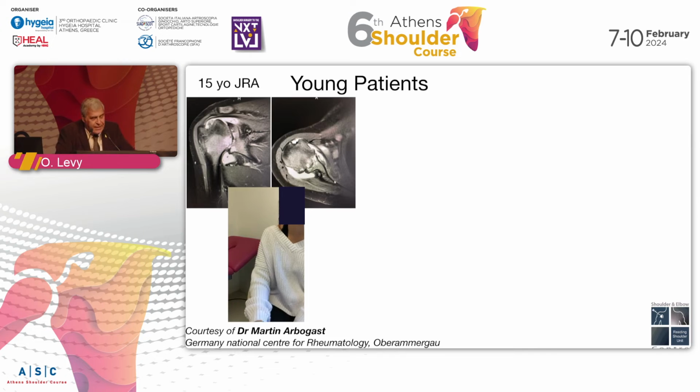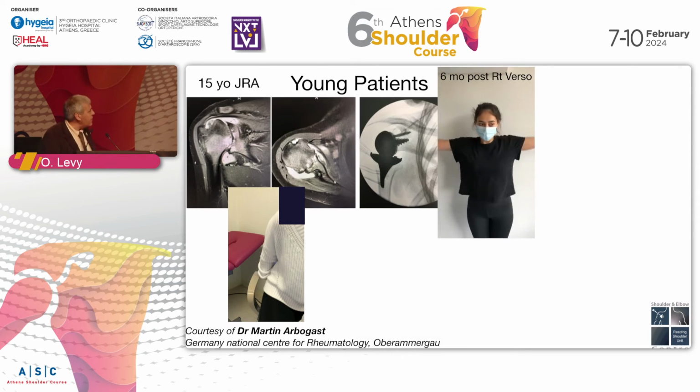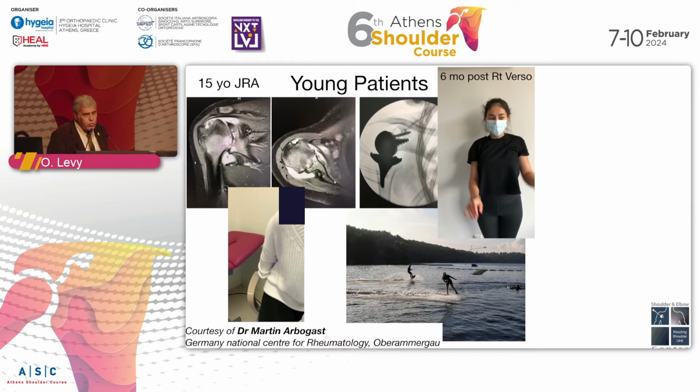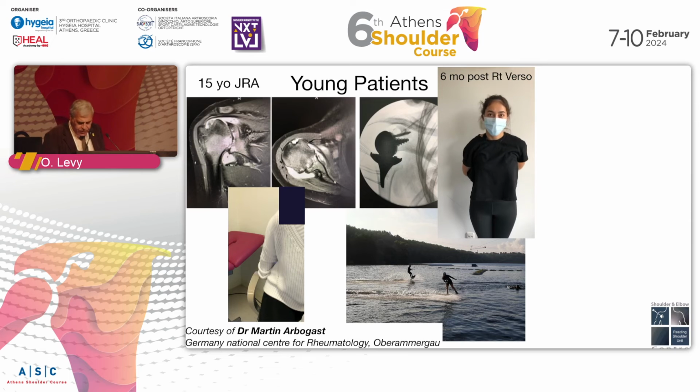This is I think the youngest patient operated with a reverse shoulder, as far as I know. It was operated by my colleague Martin Arbogast in Germany. He works in a rheumatologic center. He gets all the disasters from Germany. And this young lady, she's 15 years old with juvenile rheumatoid arthritis, very severely painful and limited. So this is 6 months after a Verso. She's back to do what young teenagers do, all the sports and everything.